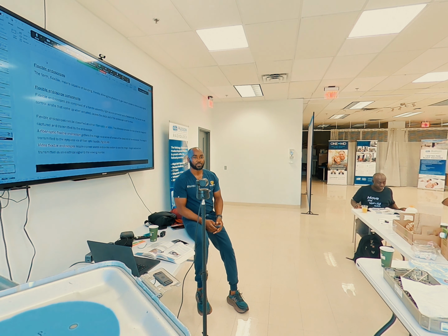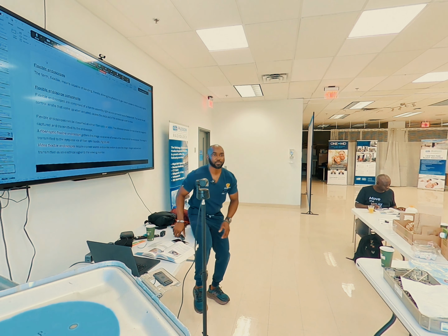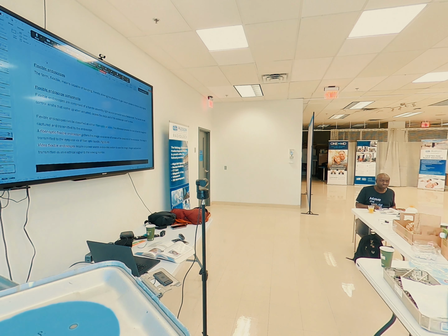In regards to state examination, let me say the question they ask at a high level is about disinfectant. Is it true or false? Can we do it manually or we cannot? So the answer should be no.